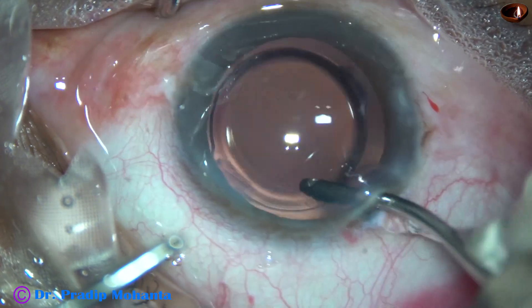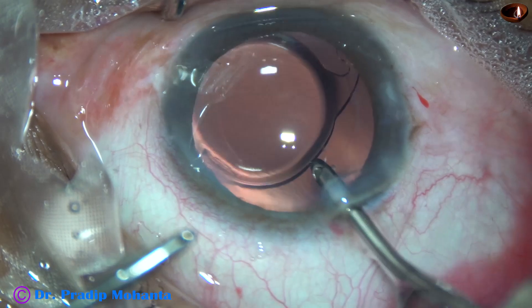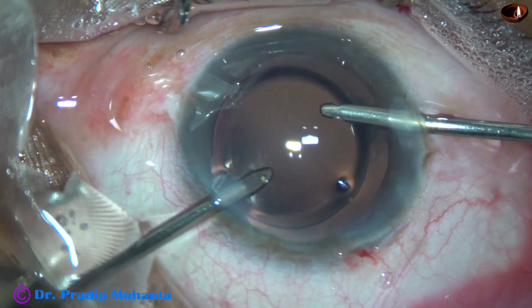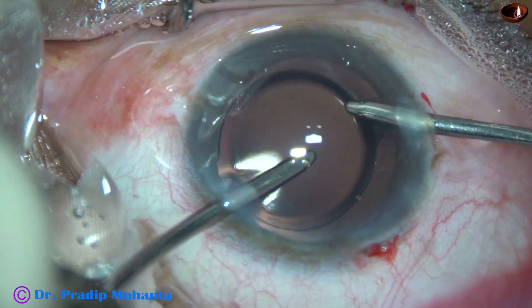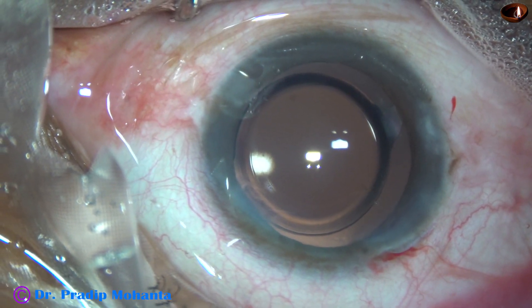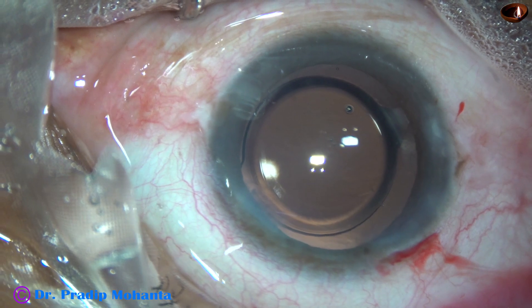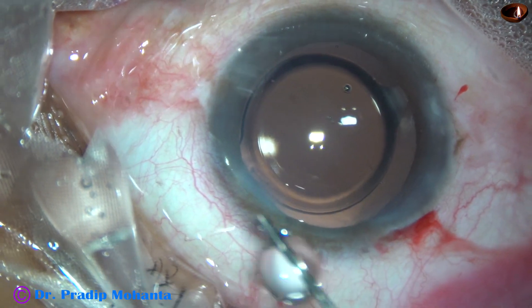Irrigate the anterior chamber, then go behind the lens and irrigate the capsular bag so that no visco gets retained behind the lens. Then I use irrigation and aspiration together. So this is a thorough cleaning of the viscoelastic substance — first by Simcoe cannula, then by irrigating cannula, and then by both irrigation and aspiration cannula.